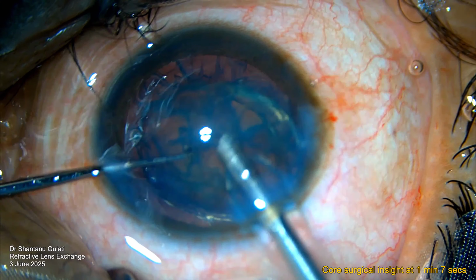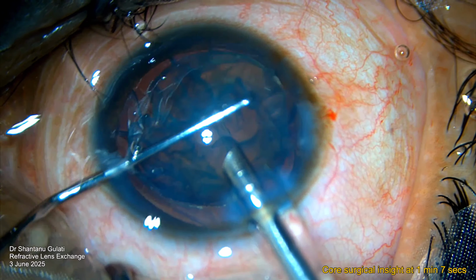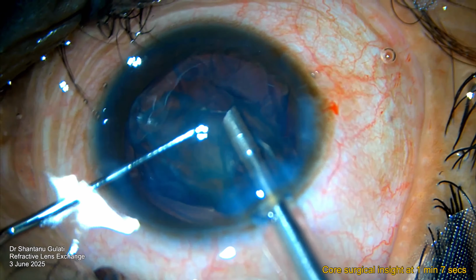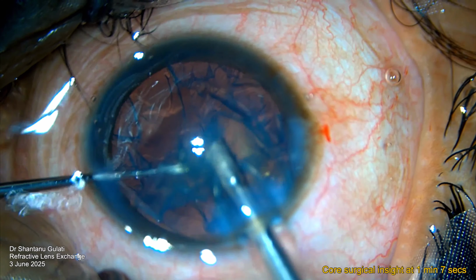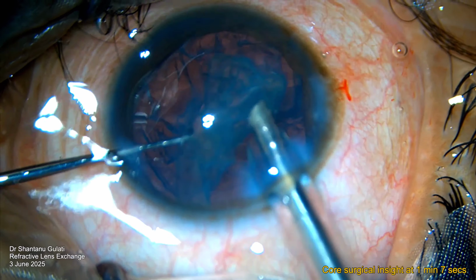In this video, I'd like to discuss something at the very core of phaco surgery, that is fluidic parameters and machine settings. A lot of beginners set low, arbitrary limits on phaco settings. Maybe it's something they heard from a senior or it was preset on the machine when they first started. And when you ask them why, the answer is usually it feels safer.